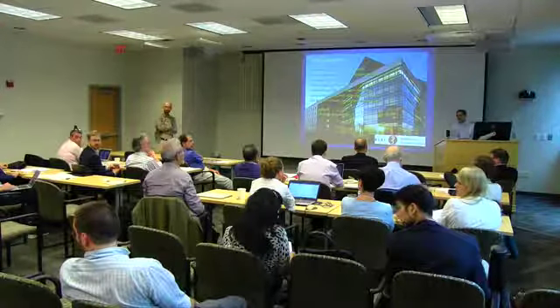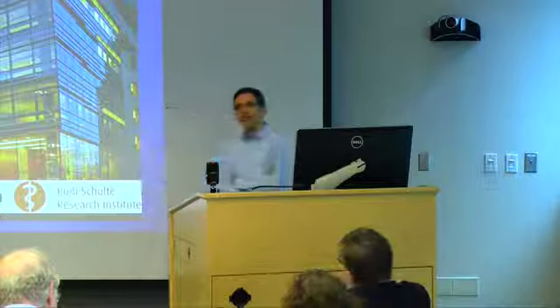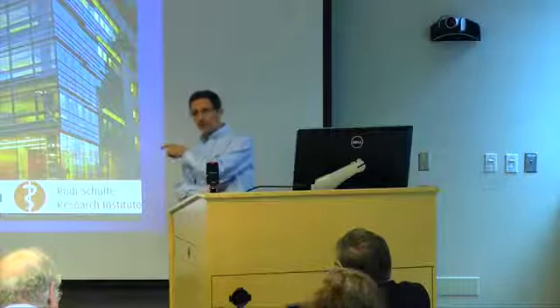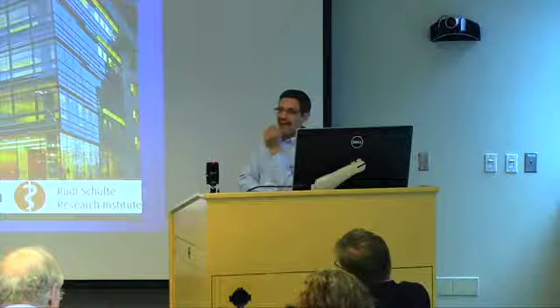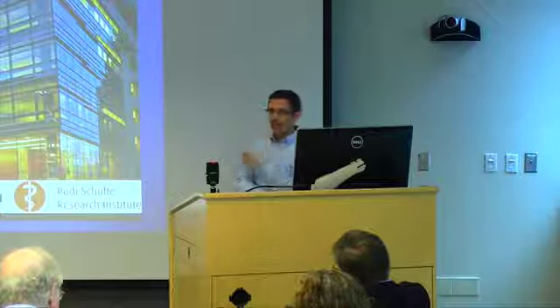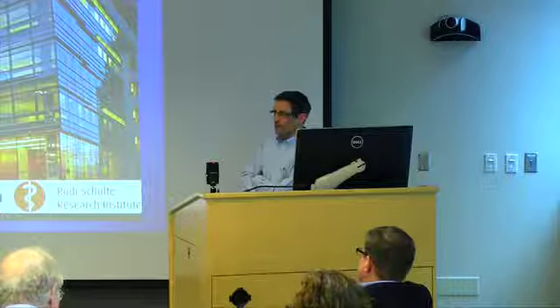I was wondering about the patients who had their brains shook. Did you have some who found it horrible? There's one who couldn't take it. One thing you have to realize is that the vibrations we're looking at in the brain, the waves, are on the order of about 50 microns. The actual shaking in the brain is probably on the order of less than a millimeter. You do feel it. There are some patients, or some even controls, who I wouldn't say find it unbearable, but they don't like it. It varies from person to person.